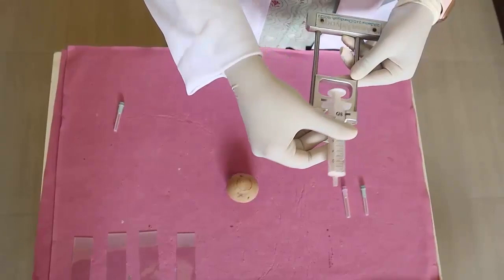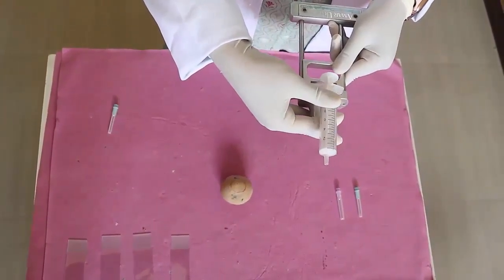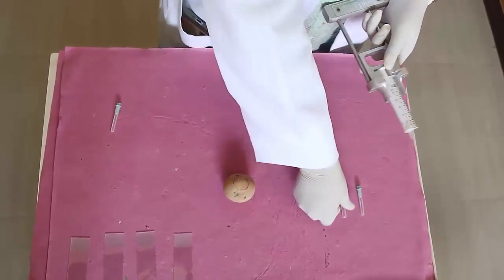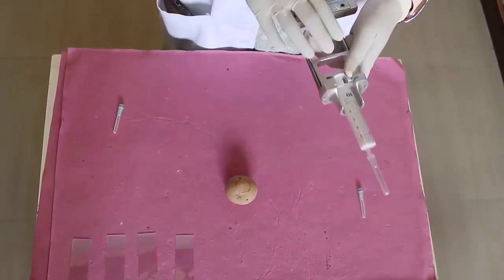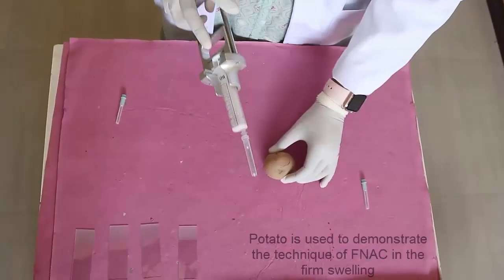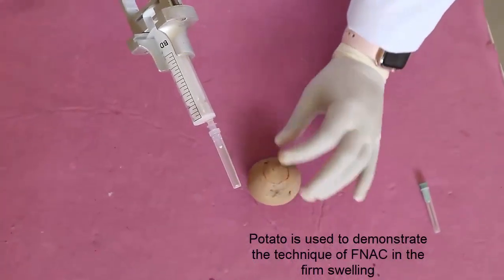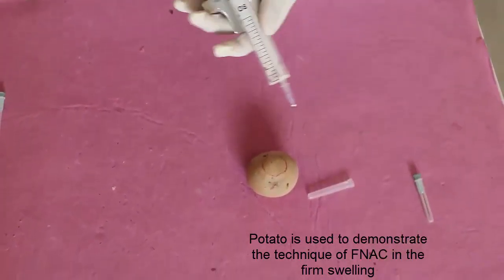A 10 cc syringe is mounted onto the syringe holder. The appropriate needle is then fixed onto the syringe. The lesion is palpated and held between the fingers to prevent it from moving and slipping. Stretch the skin slightly and insert the needle.